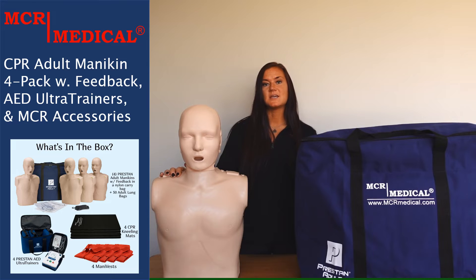These mannequins come with a three-year factory warranty against defects and workmanship, which is taken care of here at MCR Medical. Each mannequin requires two AA batteries, which are not included.